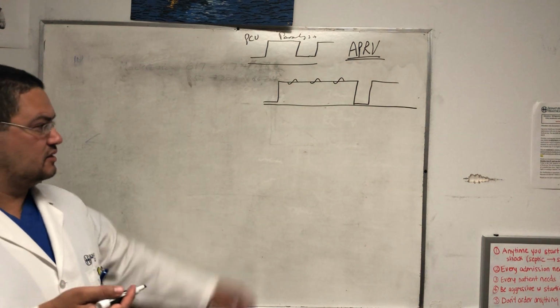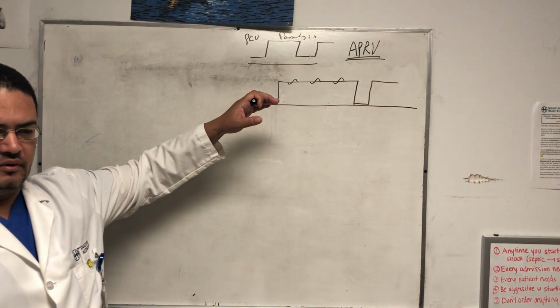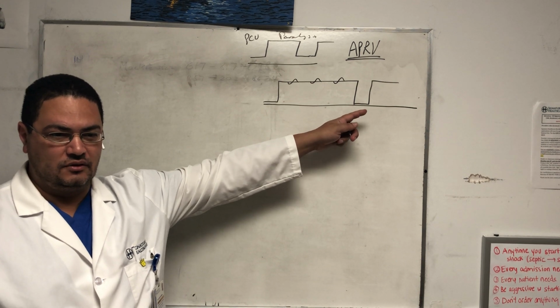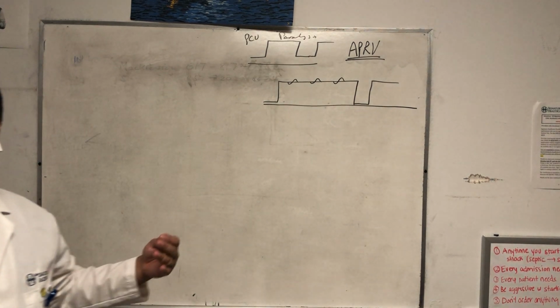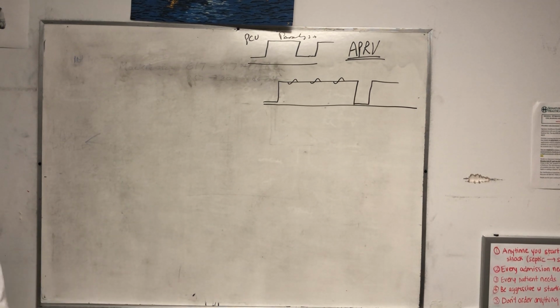They feel as if they're just on a high PEEP, breathing over the high PEEP. And every once in a while, every 6 or 8 seconds, something weird happens like this. Okay, we'll breathe again. For the patient, it's really very comfortable to breathe on your own whenever you want, whatever amount you want.